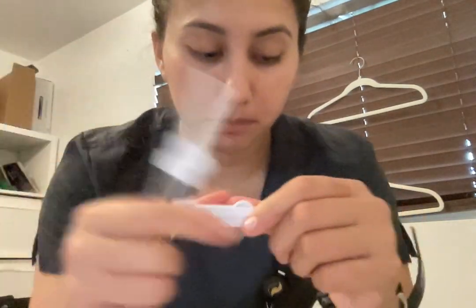So for my primary tubing, I have the spike, the chamber, clamp, Y adapter or Y tubing, and the port. Spike lets me poke the bag in order for the fluid to go into the chamber. With the chamber, the fluid stays in there, and I can adjust the drops by using the clamp.